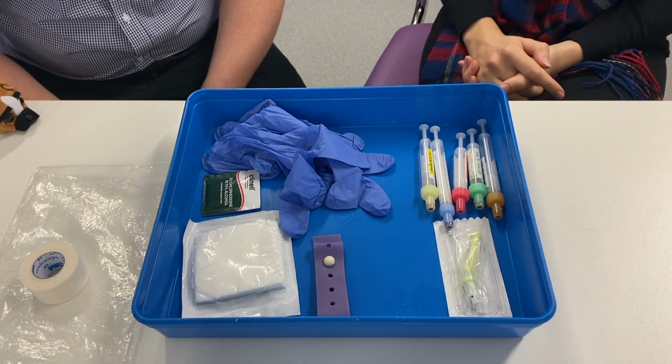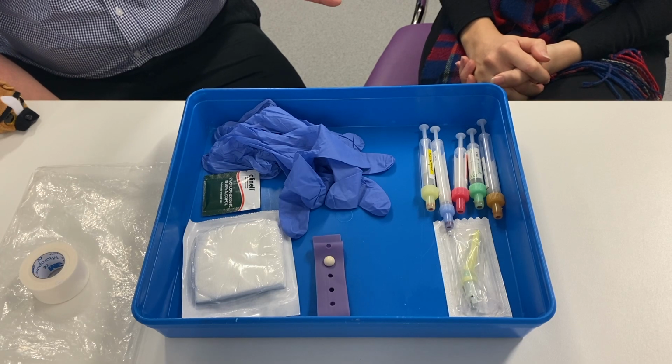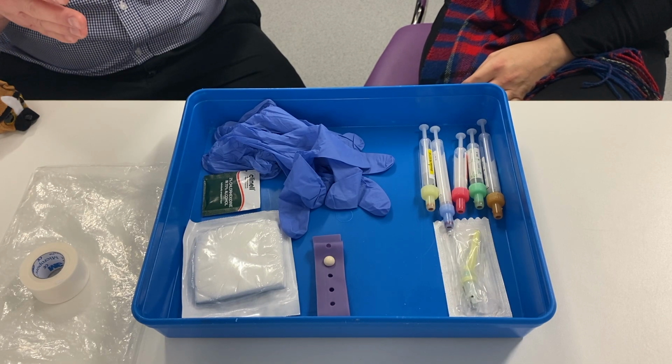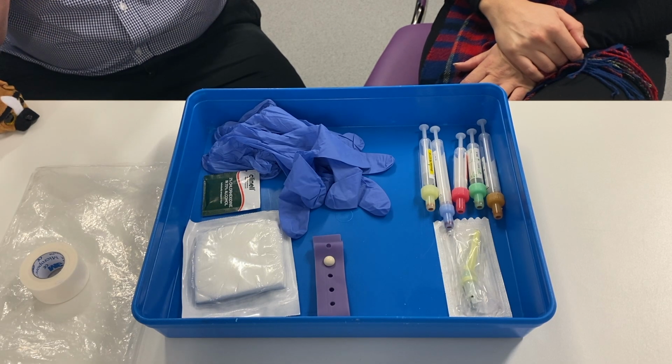Okay, so hello everyone. So we're just going to quickly talk about how we would prepare our tray before we go and see our patient. I think preparing the tray, I would tend to always, I don't know about you, Tina, but I'd always do it away from the patient, just because then it gives you a chance just to go over the things you want to do in your mind, and hopefully it will make you feel less anxious and under pressure so you're not being watched by the patient.